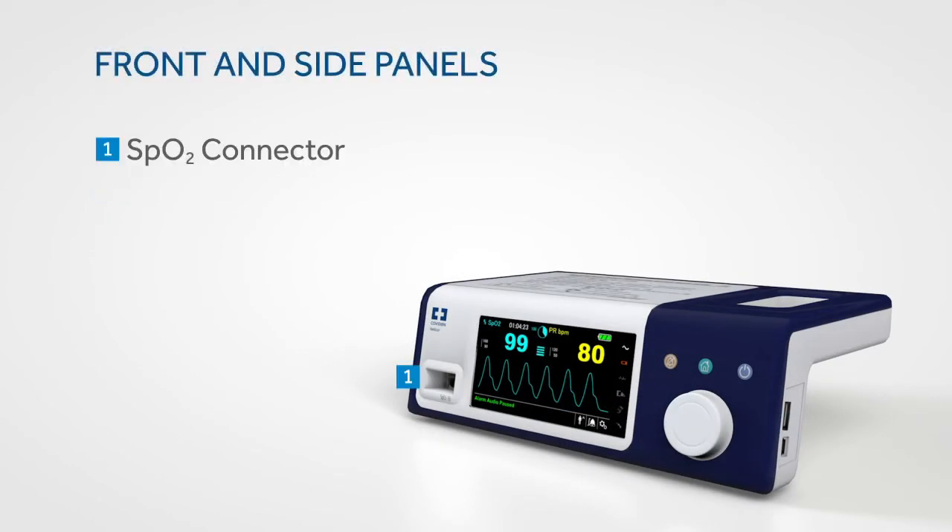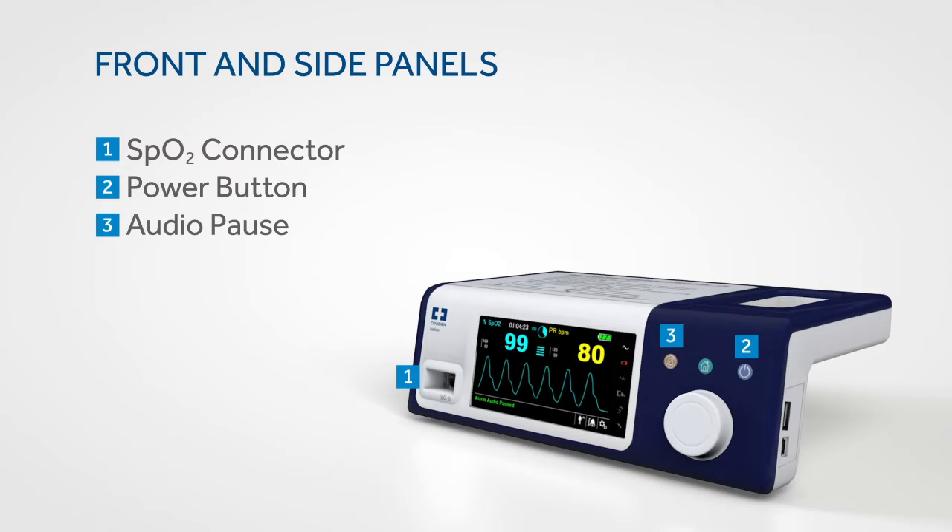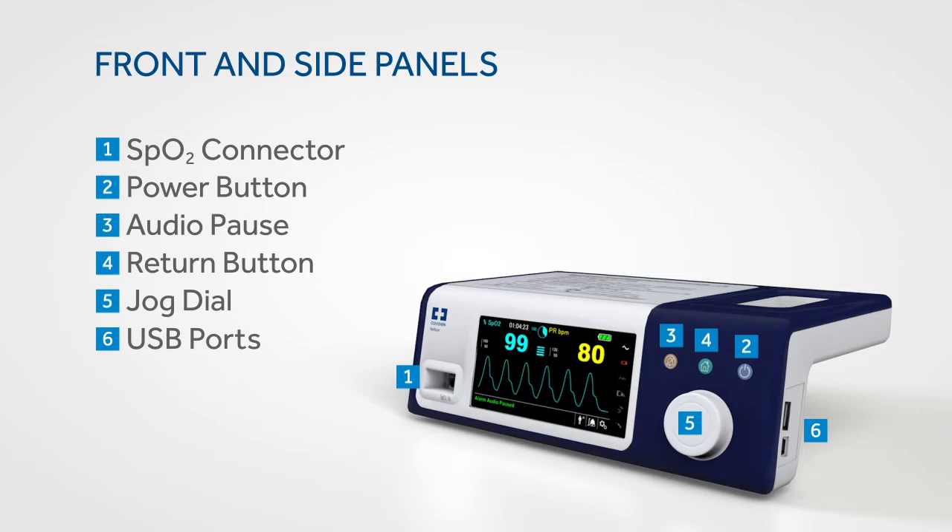The front panel provides the connection to the SpO2 sensor. The power button is on the top right of the panel — just press and hold the button to turn the monitor on or off. Easily accessible buttons allow you to silence alarms for a set amount of time and to return to the main screen. A jog dial controls system functions. On the side of the monitor you'll find USB ports for data downloads and system upgrades.